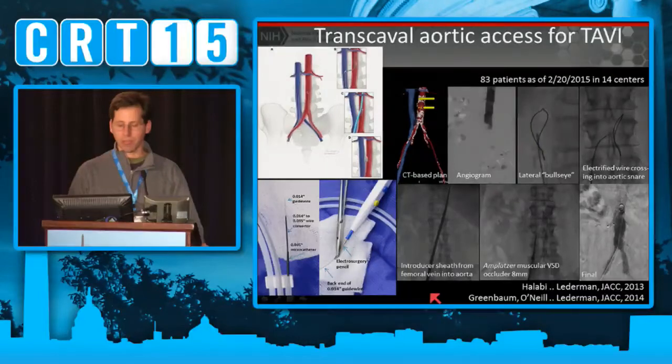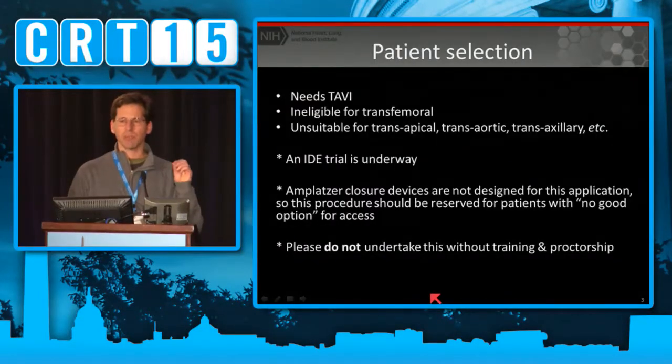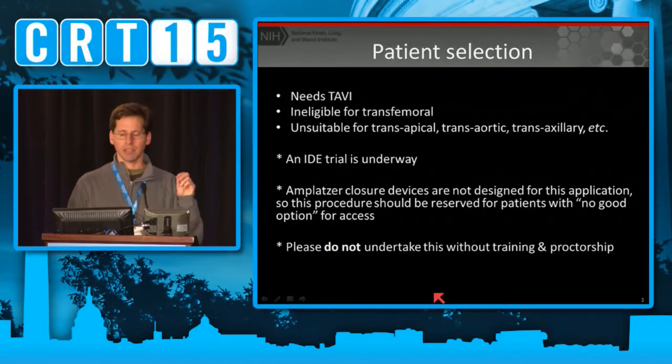There are a few published papers. I'm just going to give you a little bit of a taste today. It's pretty important to know that I don't think you should undertake this procedure based on this lecture or based on a little bit of reading. Please ask for some proctorship and some teaching if you think your institution should adopt this.